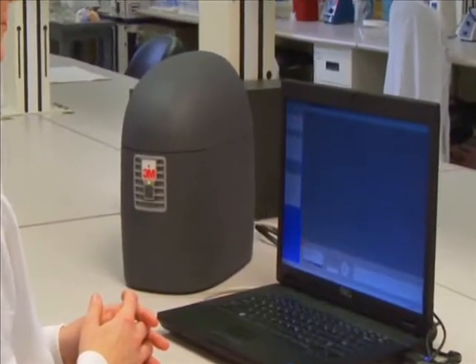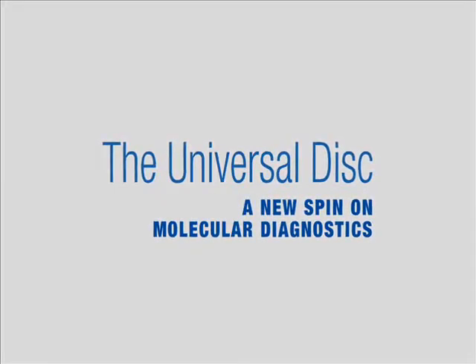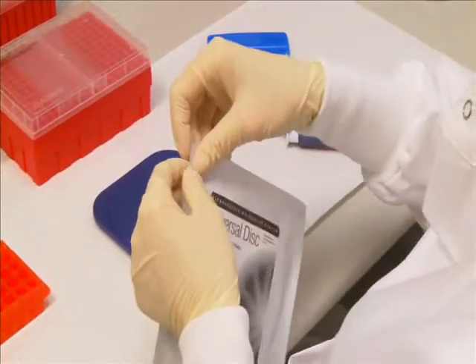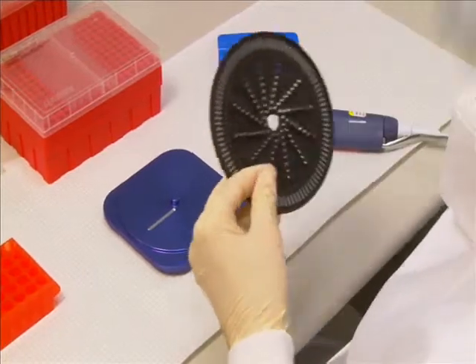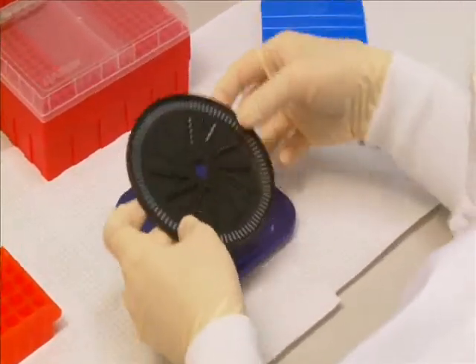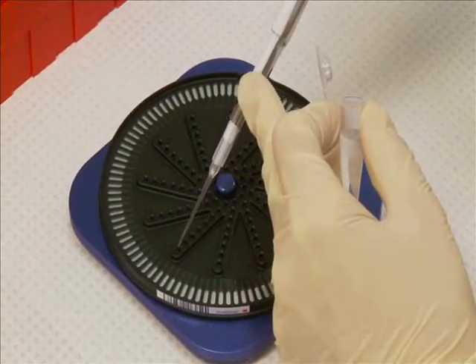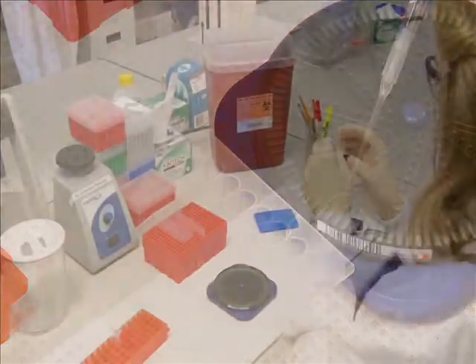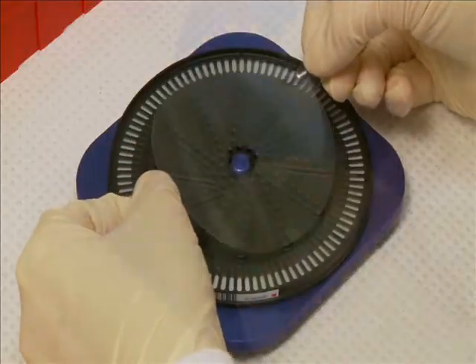Able to process up to 96 samples simultaneously, the Universal Disk puts a new spin on molecular testing. With the Universal Disk, you have flexibility as to where you load samples, in addition to running tests with similar parameters on the same disk. Simply load the Universal Disk with the reaction mix and the extracted DNA. To help ensure sample integrity during processing, seal the disk with the Universal Disk proprietary adhesive.